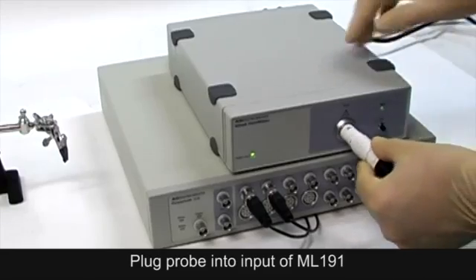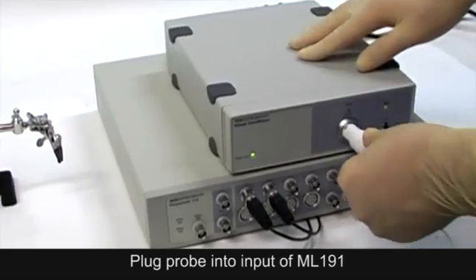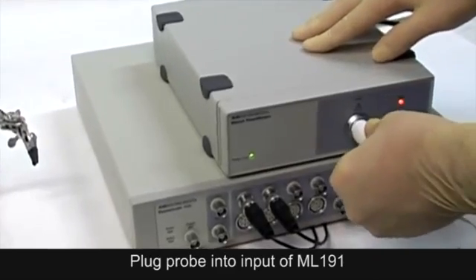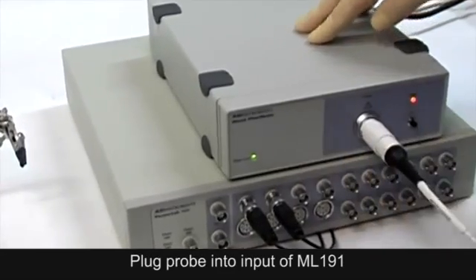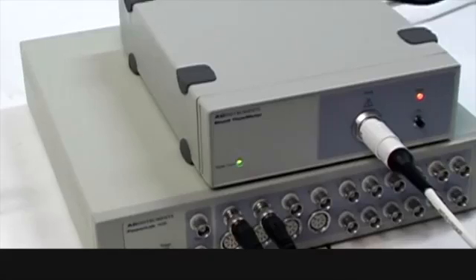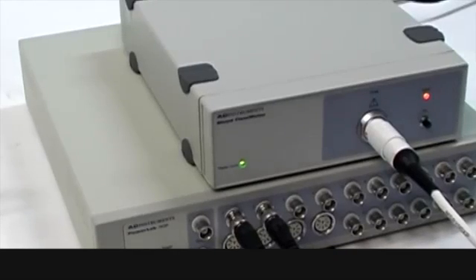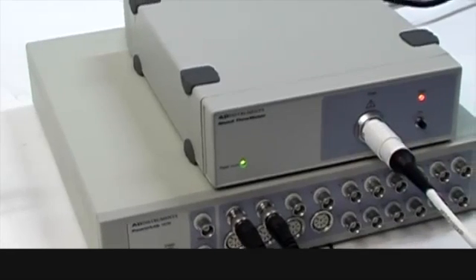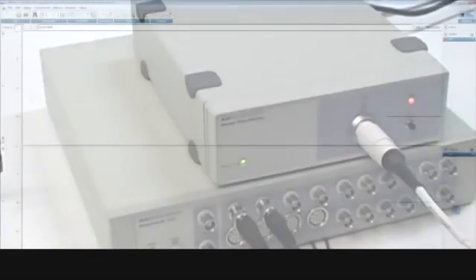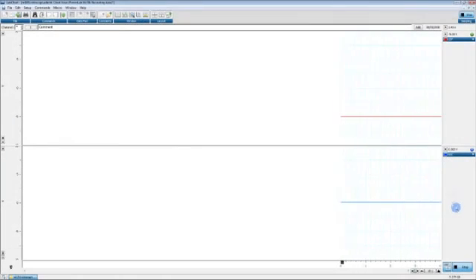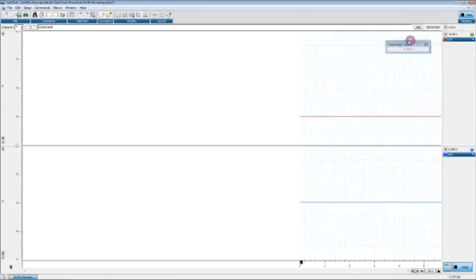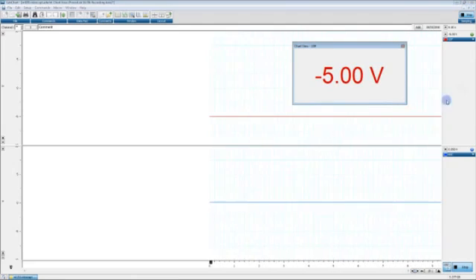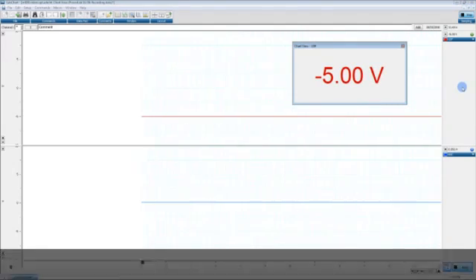Two. Plug the probe to be calibrated into the probe input of the ML191. The indicator light on the front panel of the ML191 will change color from green to amber. If a probe is unrecognized, that is, not previously calibrated, the ML191 laser Doppler flow channel will output a negative 5 volt signal.